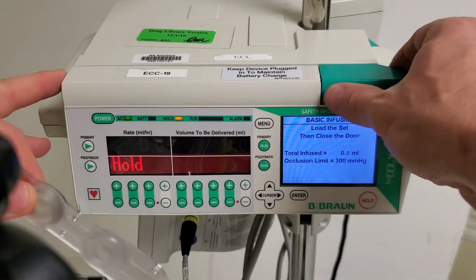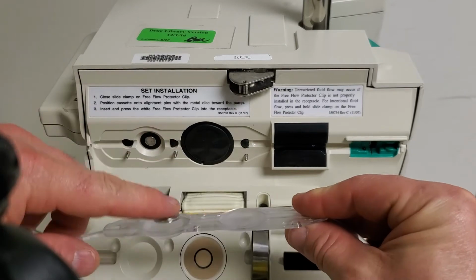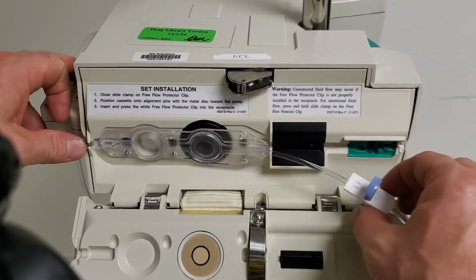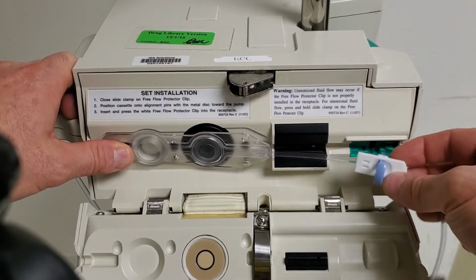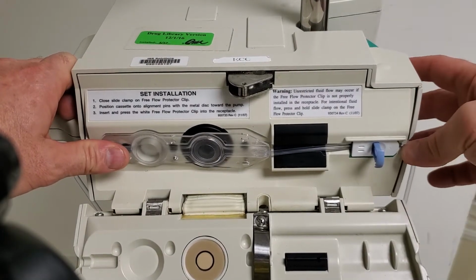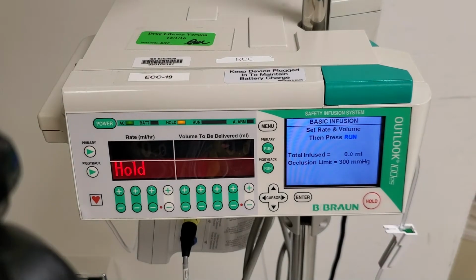Once you've done that, you open the door by pulling the green lever. There's a magnet in the pump and on the cassette. You line those up. There's posts that go through the bottom of the cassette. The IV tubing goes through the guide on the left, goes through the air detector, and the anti-free flow clamp goes in the green spot, and then the tubing goes through the channel on the right. Close the door. Now the pump is ready to run.